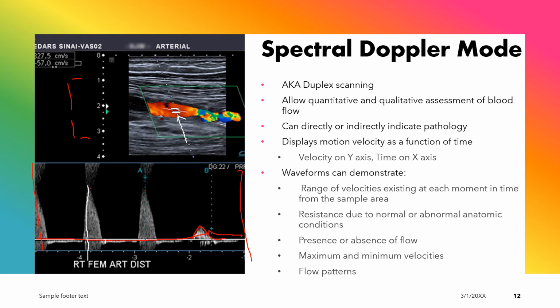As we go forward, you would see that sort of pattern would continue until the next systolic contraction, and then you would see ranges of velocities from this maximum number all the way to the minimum number. Now, sometimes your velocities are not going to have such a large range. Hopefully, if you have a nice, clear common carotid artery, you'd have velocities between about 80 to 70. And so it would just represent those velocities in that range at that moment of time. So that's how our spectral display is created, by taking that velocity information in this particular area at that particular moment in time.